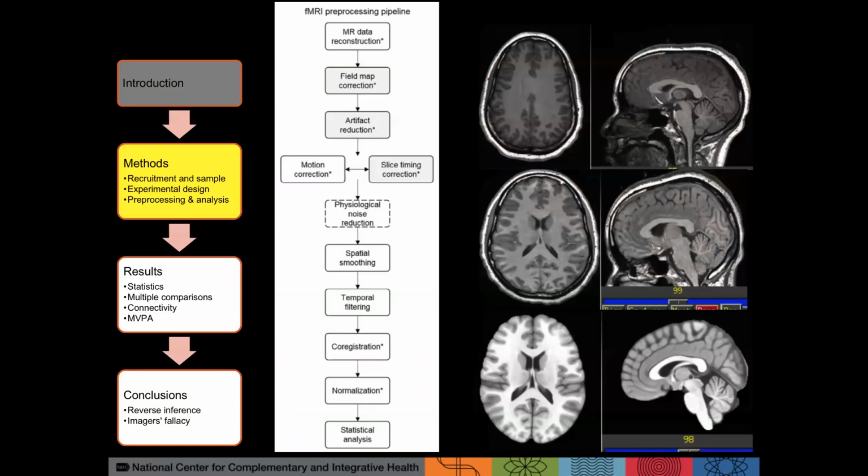Now, one step that is important to mention, so we've been looking at the functional MRI data, but this is structural MRI data. This is a subject's brain in the original space. So this is like the space of their actual skull as imaged in the MRI scanner. And in order to look across subjects, what we need to do is what's called normalization, where we use those programs I talked about to figure out how to register their brain with this template, the Montreal Neurological Institute template. And so what you see that, in this case, AFNI did, is it bent the subject's brain in different dimensions so that it's in the same space as the template.